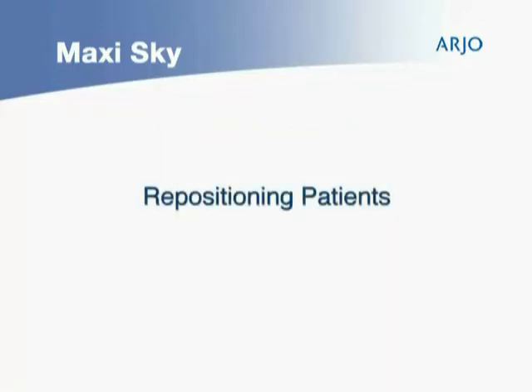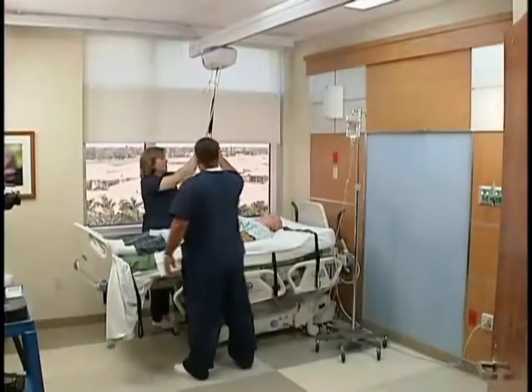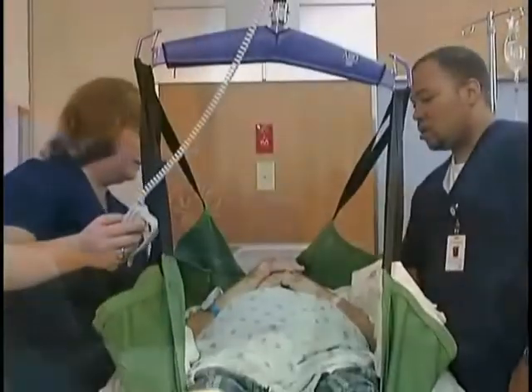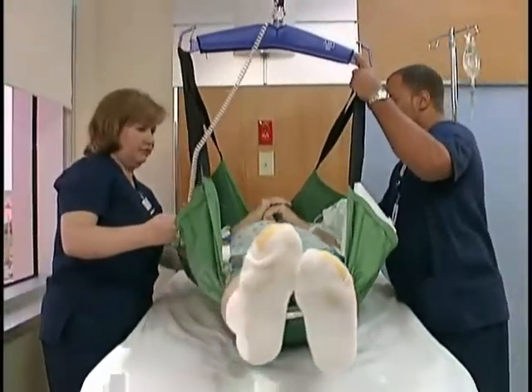The MaxiSky is also ideal for repositioning patients with a repositioning sling. Prepare the bed with a sling under the patient, and when the time comes to move the patient up in the bed, connect the straps to the hanger bar. Elevate the patient and allow momentum to slide the patient up in bed.